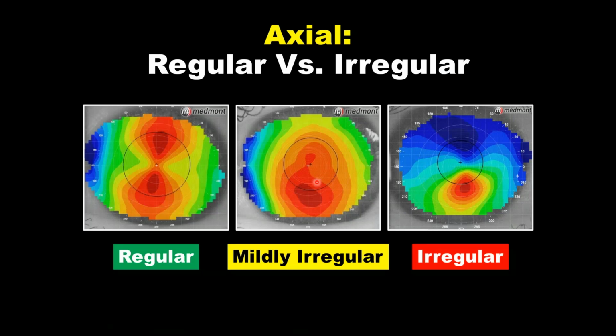So the topographies are incredibly valuable to us in so many ways, and one of those is simply to understand vision. If we look at this high corneal astigmat, we would expect, because it's such regular astigmatism, this patient should do very well for vision. We can correct this patient with glasses, soft lenses, rigid lenses, anything.